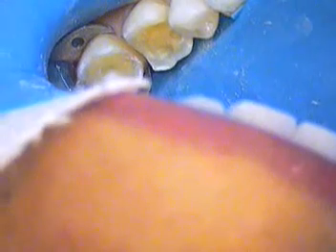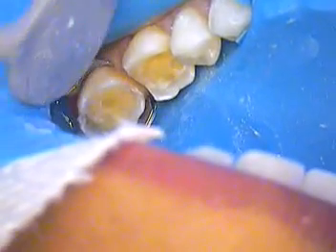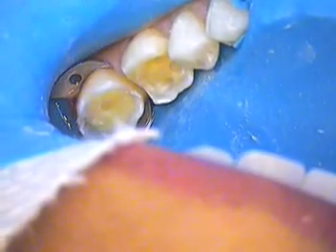We may fill in some of these voids with some core paste material, which is another product I like to use — Core Paste from Denmac Corporation. That will give us a much more uniform surface so that we can transfer that detail to our laboratory.